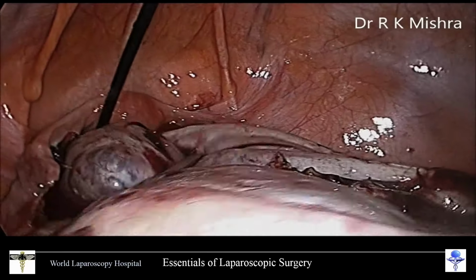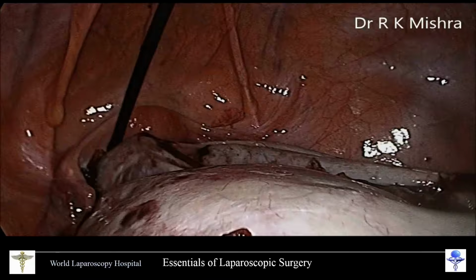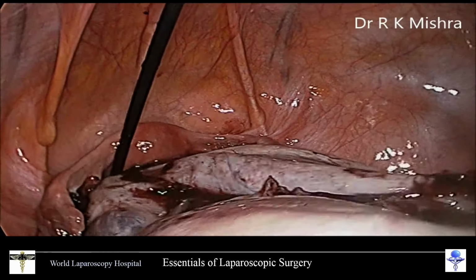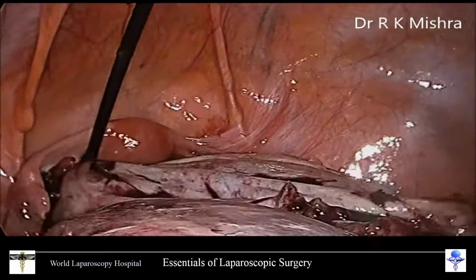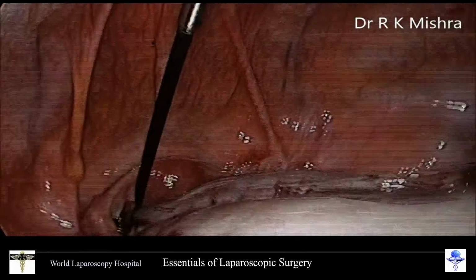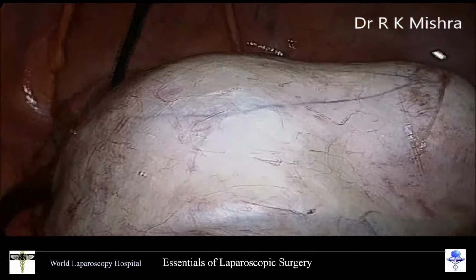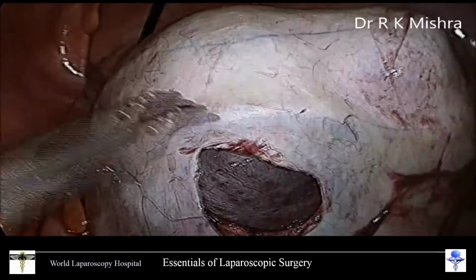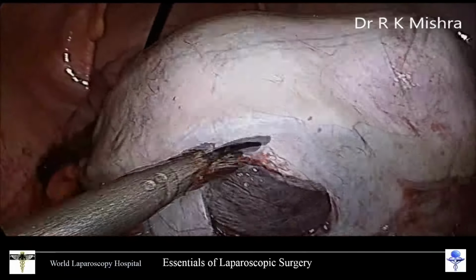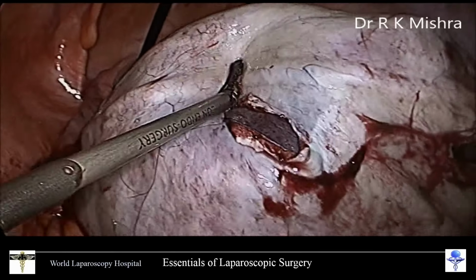Yes. This was later, once the biopsy was done, a mucinous cystadenoma, borderline. In that, the recommendation is that a repeat diagnostic laparoscopy has to be performed after 2 months, so that you can see the peritoneum, and if you want you can take a peritoneal biopsy. But it is not a contraindication. You can perform laparoscopy, it can be done.